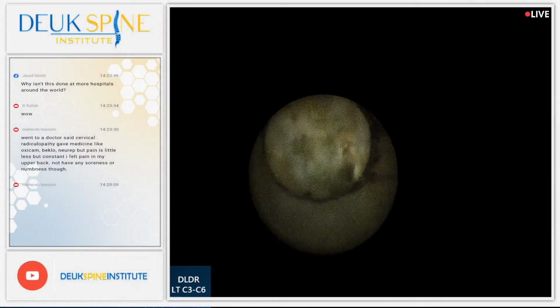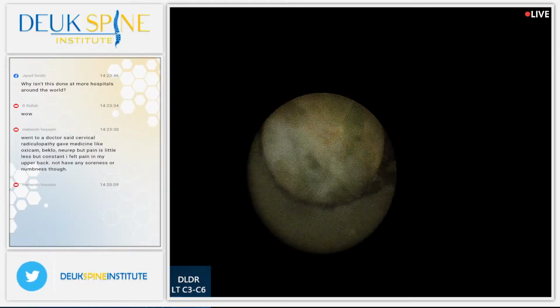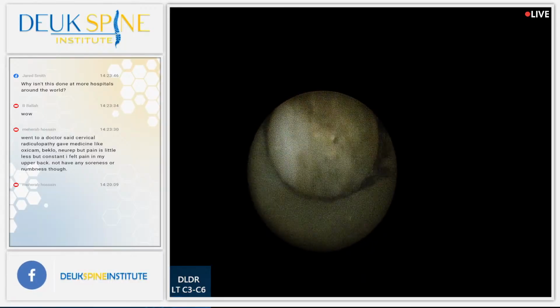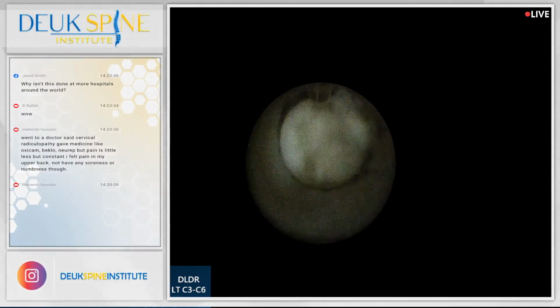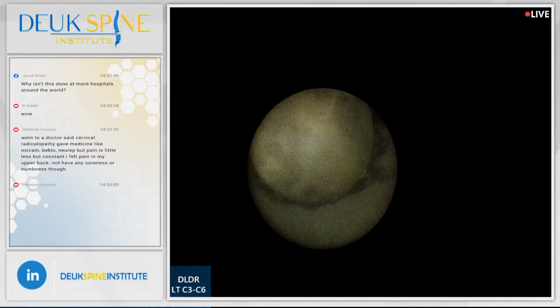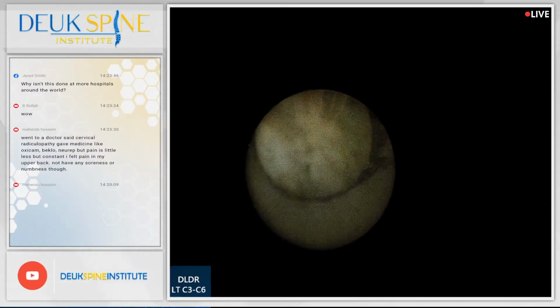Are you saying there's a machine? Yeah, that tells you the power that the laser fiber is. So where is that machine? This machine is like $3,000. How much? Like $3,000. Then buy it. You want it? Yeah, I want to test these fibers, because if the fibers are not transmitting, then we need to get new ones or replace them.